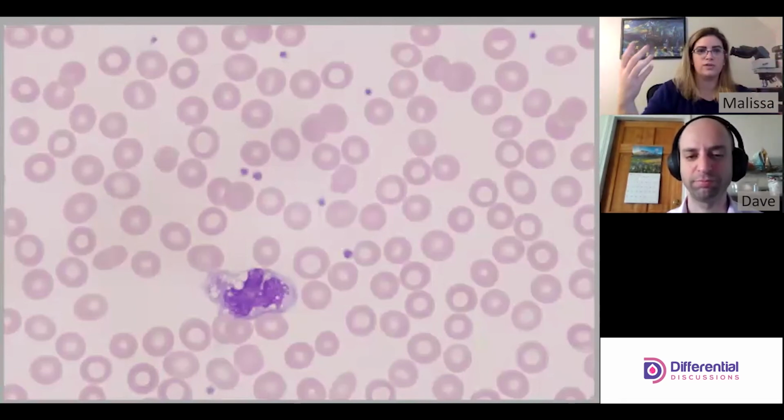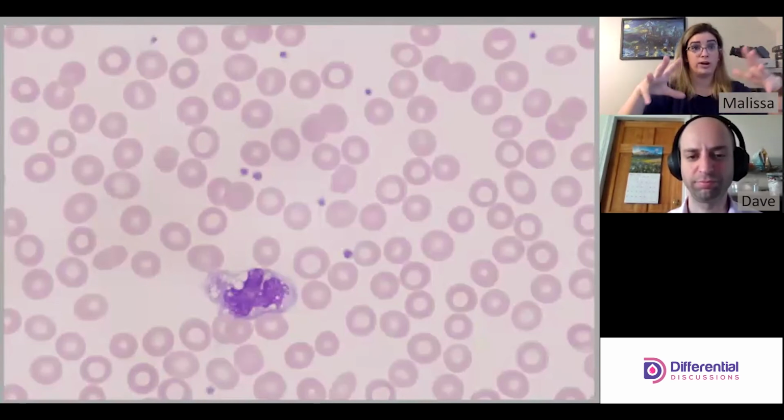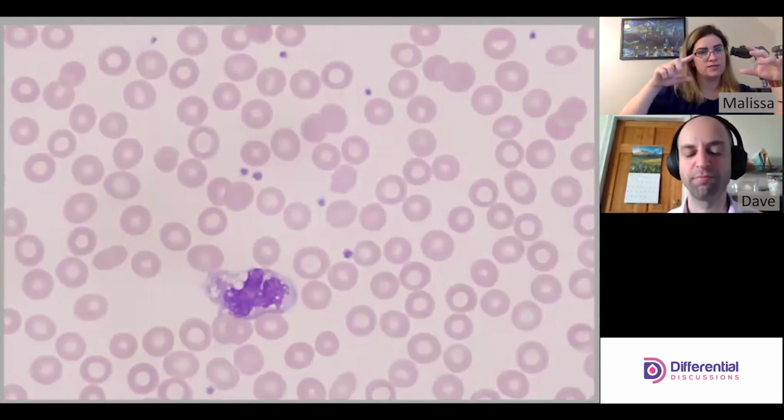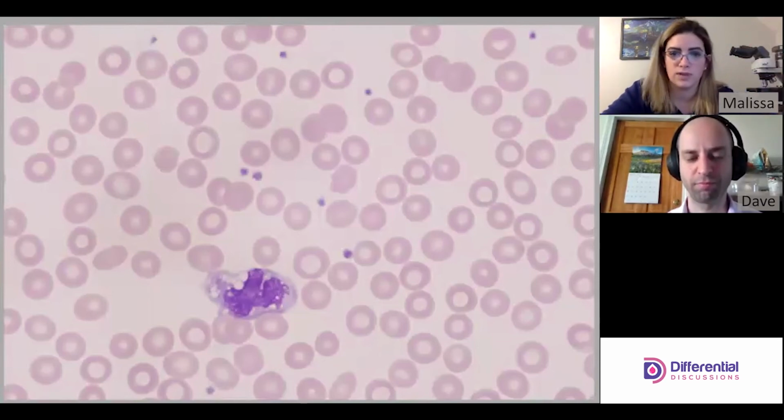They're finely woven through the nucleus subtly, very not bright white, the way that we see in clumpy neutrophils. It's more of an off, subtle white. And then it's not even, it's a nice squiggly line all throughout. That's generally how I describe monocyte chromatin patterns.